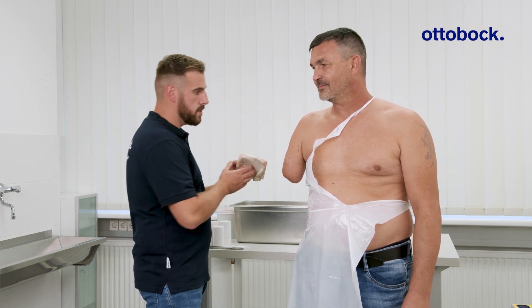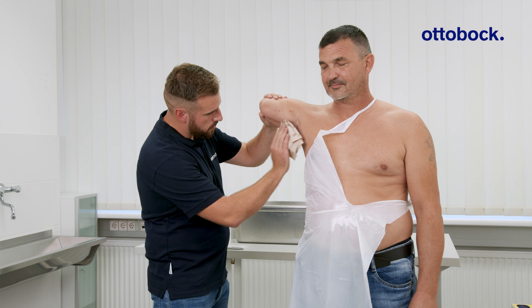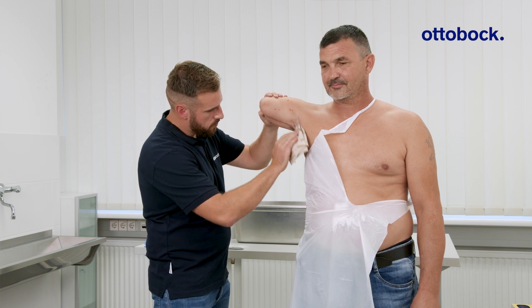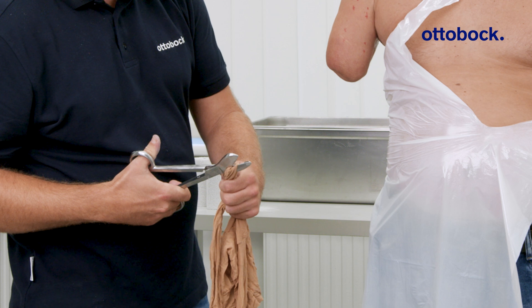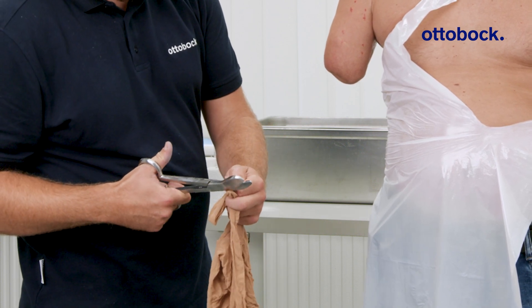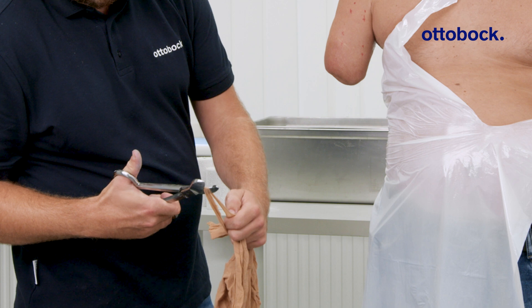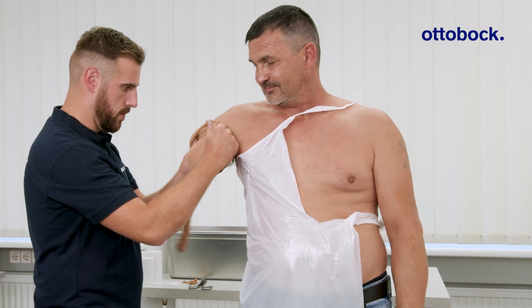Begin by applying insulating cream to the axillary area. Then prepare a nylon stocking to provide insulation and gentle compression, and place it over the residual limb.